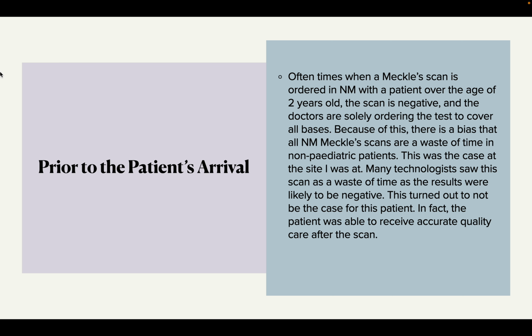So before the patient arrived, in Nuke Med, the scan isn't seen very often. It's normally something done in pediatrics, and like we say, the rule of 2s. It's normally seen in patients under the age of 2 years old, and in males. Because of this, there was a little bit of bias that came in from some of the technologists, that it's kind of a waste of time. She's 47 years old and she's a female. It's probably not going to be positive.